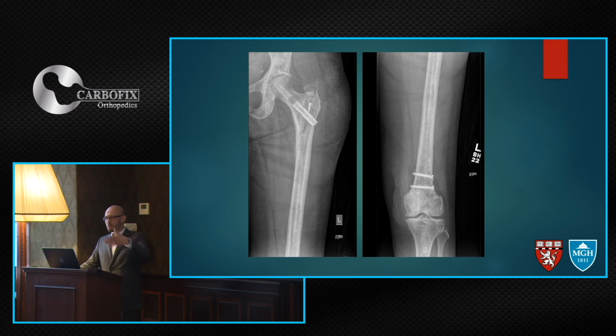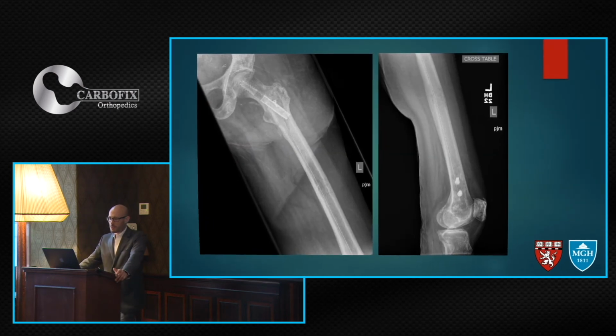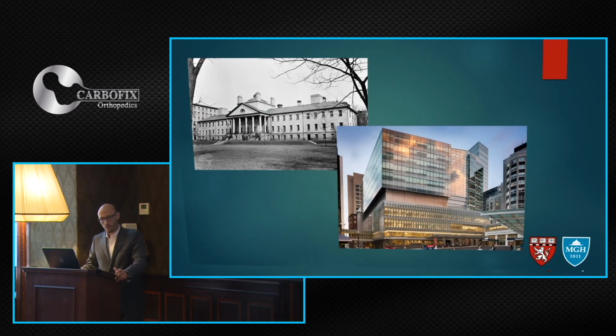Did that change the management of the recovery of the patient? No, but she had a significant amount of pain post-op because of this fracture, compared to if she would not have had the fracture. So this is something that doesn't happen that frequently, but I think it is a good example to show that you actually can see how the bone is reacting when you're inserting the implant, especially in patients with extensive disease. So you see a fracture there. You see a great modulus of elasticity. She's on chemo and she already is forming some callus. This is a 6-week follow-up and she's doing well so far.